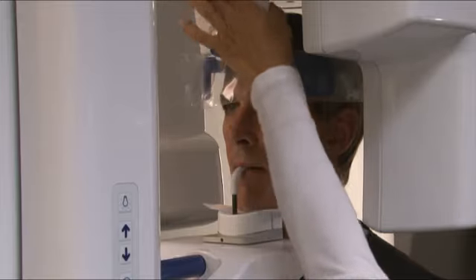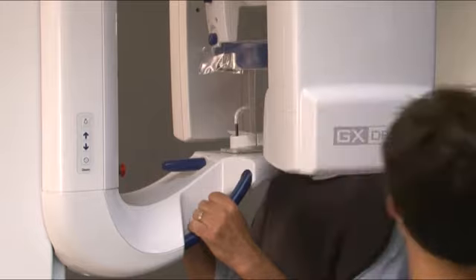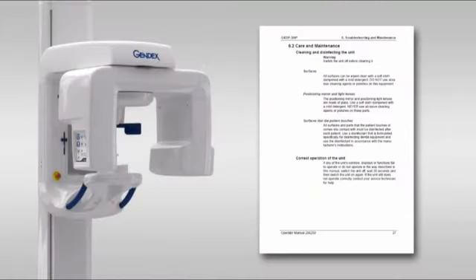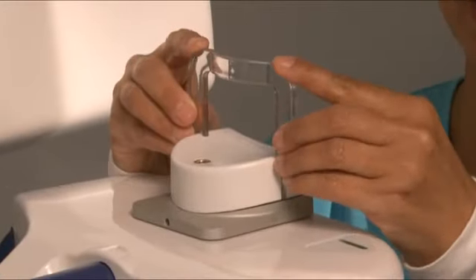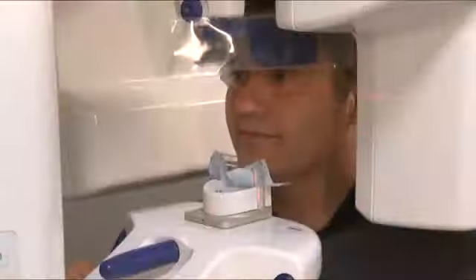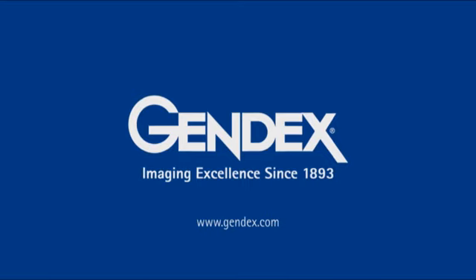After the exposure, release the head support and assist the patient in getting out of the unit. Follow the instructions in the manual for decontamination of system parts. Note, for edentulous or partially edentulous patients, be sure to use the appropriate positioning device. For more information on proper positioning and usage of the GXDP300, please consult the user manual.